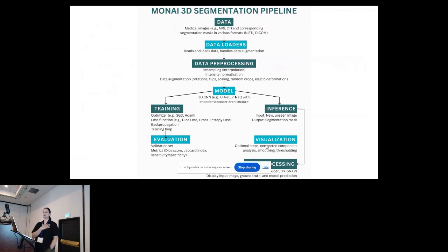So let's say we have 50 patients who have anywhere from, let's say, 1 ml to 400 ml of hemorrhaging, like blood, in their brain injury. And what we have along with that is annotation. What I mean by annotation is the region of interest in the brain where the injury has happened and where the blood is pooled.